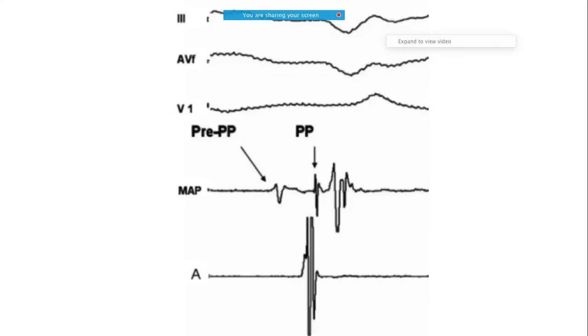So I was talking to you about those potentials, which we can see, especially if you go inside the heart, especially during the procedure. So this is how it looks like. As I was telling you, the Purkinje potential is very distinct from the A and V, which one may be able to see. For example, if your catheter is going to be there in the ventricle, in that area, I'm going to talk more in detail. Just before the V, you will start seeing two different kinds of potentials.